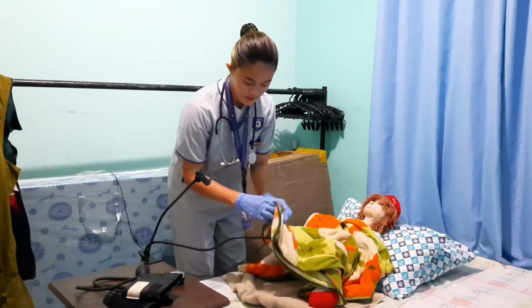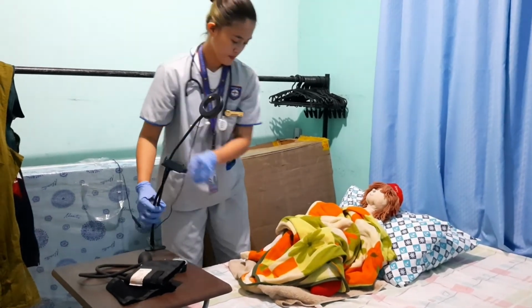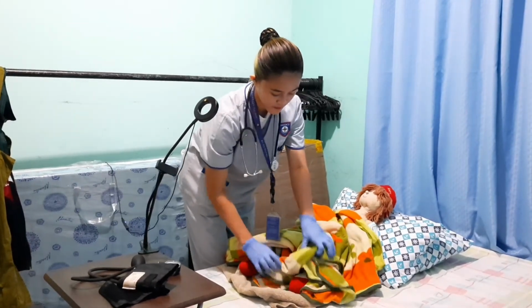And once done, after the prescribed duration of treatment, remove the heat lamp, loosen the diamond draping, and cover the patient with the top sheet. Place the patient in a comfortable position and do the aftercare.